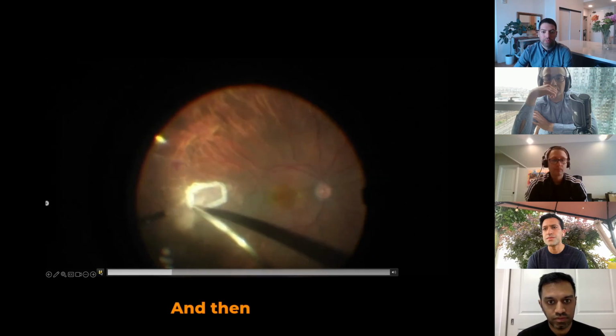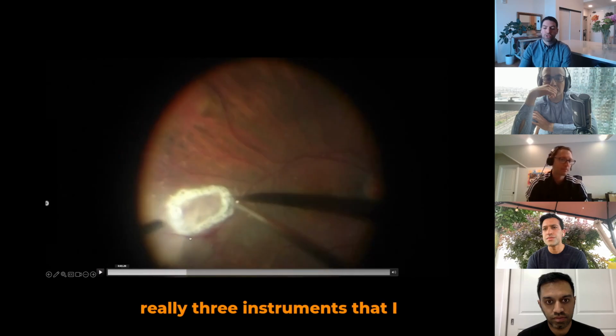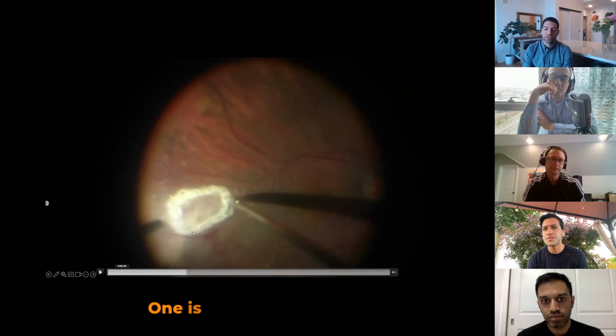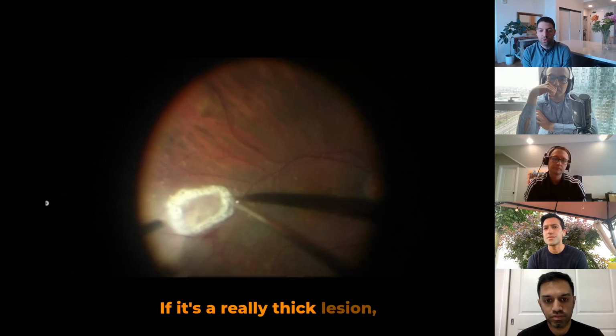And then I'm sure there's other instruments you could use, but there's really 3 instruments that I can use to start my dissection. One is a vertical scissor, which I love for diabetics and I love for this. The other is you can just use your cutter. If it's a really thick lesion, you can lower your cut rate and turn your cutter into a vertical scissor.